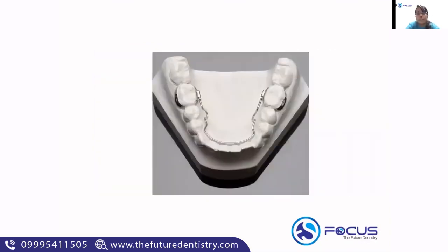Now, what is this picture? What is this appliance? Yes, very good. It's a Hart's lingual arch. That is a U-loop there. So it's a modification of the lingual arch. It is a Hart's lingual arch.